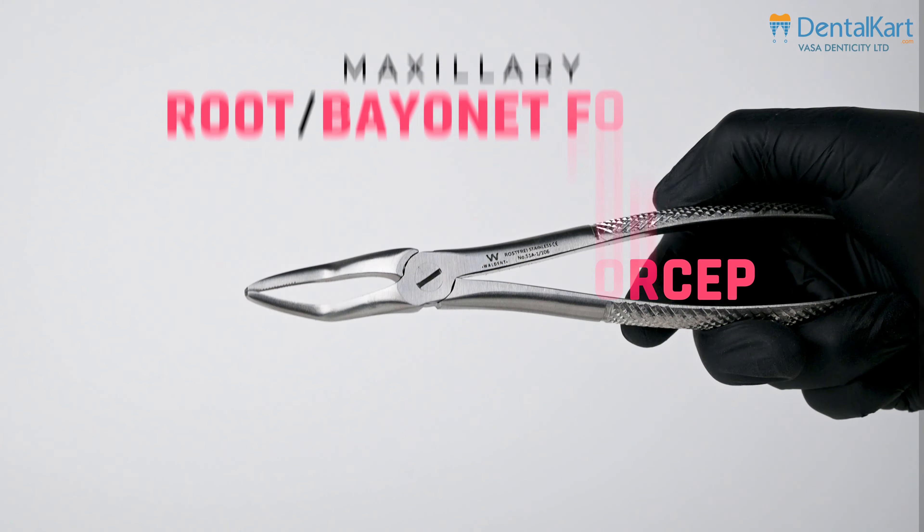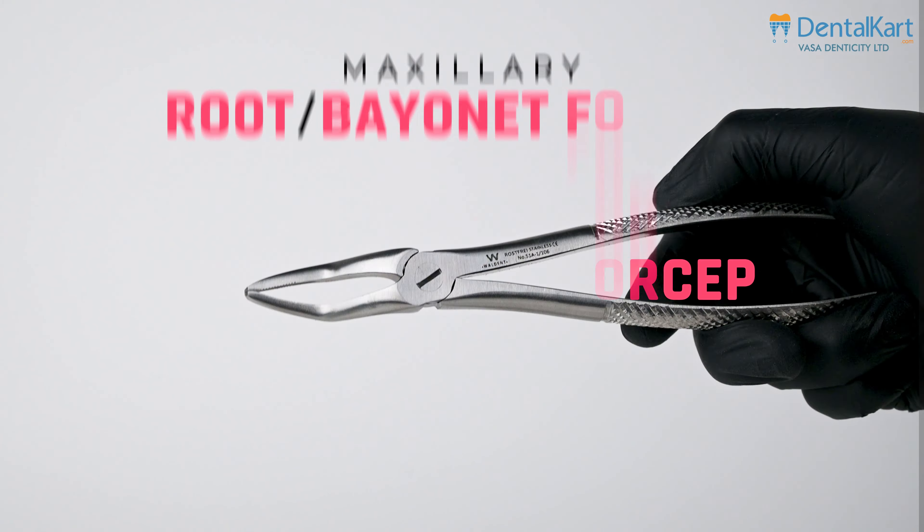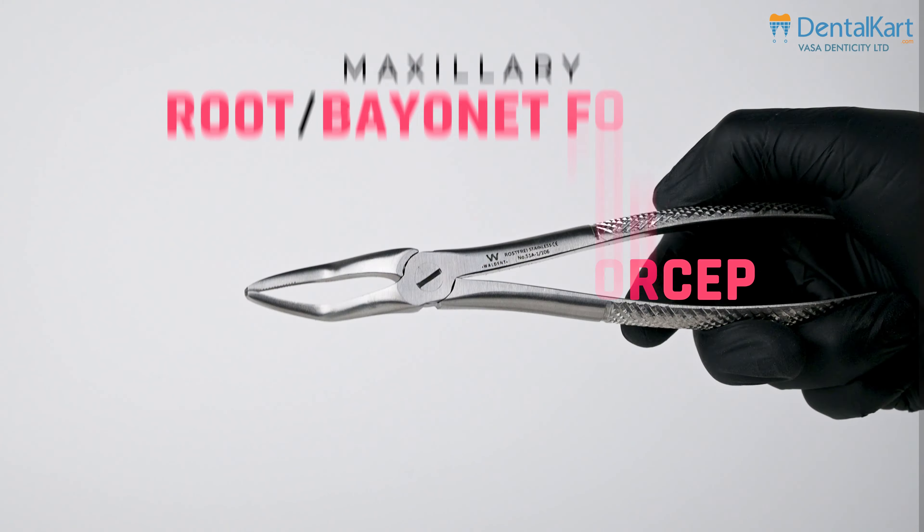Maxillary molar forceps are uniquely designed with an S-shape, featuring one rounded beak and one pointed beak. This matches the structure of maxillary molars, which have three roots — one palatal and two buccal. The rounded beak fits onto the palatal side while the pointed beak grips the buccal surface above the CEJ, making extractions comfortable and efficient.